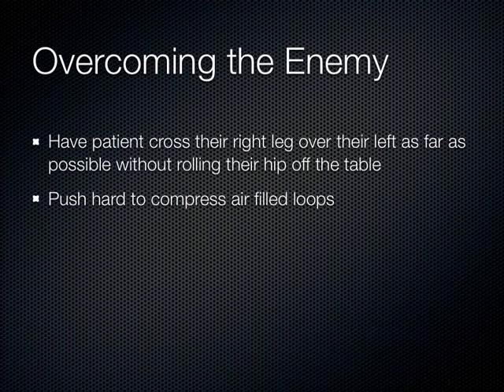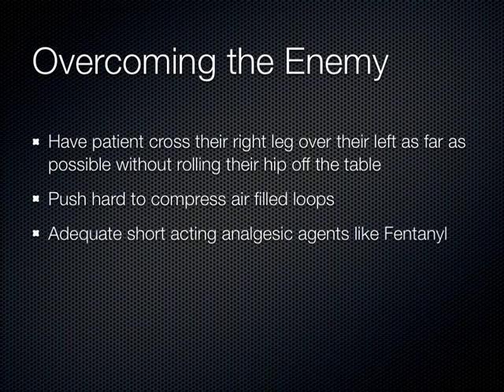And the other thing is you're going to push pretty hard to compress these loops, harder than you would imagine. Now, the group in the last session on Tuesday was asking me, hey, wait a minute, how hard do we really need to push? It seems like that'd be uncomfortable to the patient. That kind of goes against our teaching as doctors. And that's why we have medications, these narcotics, when we do this, like fentanyl.